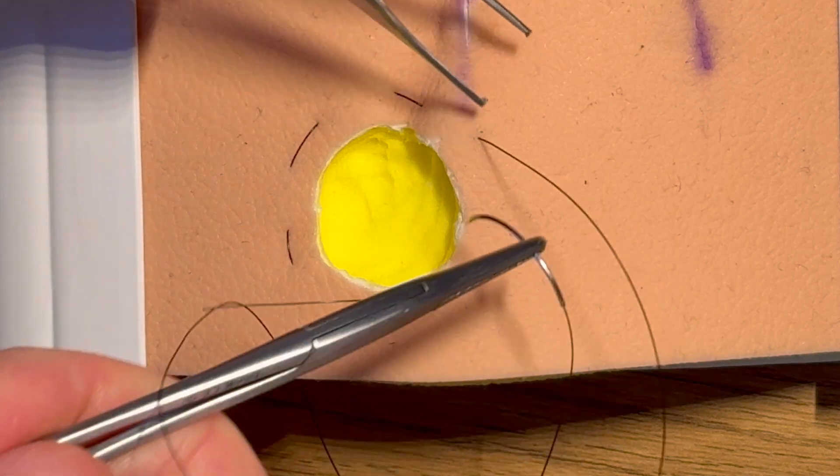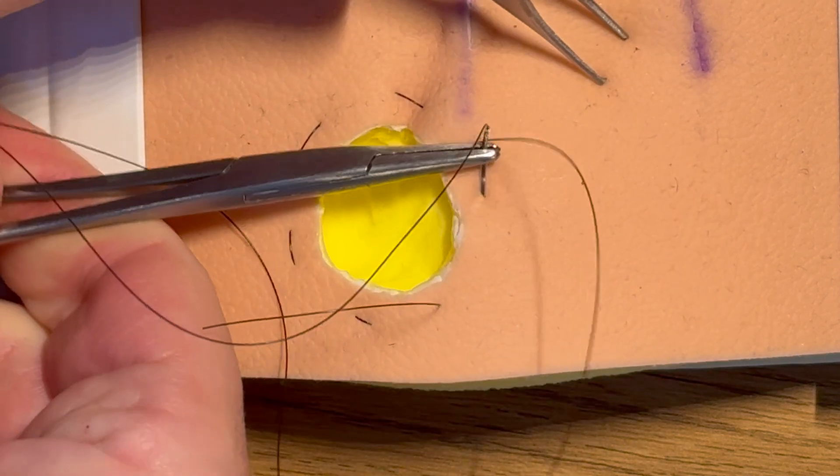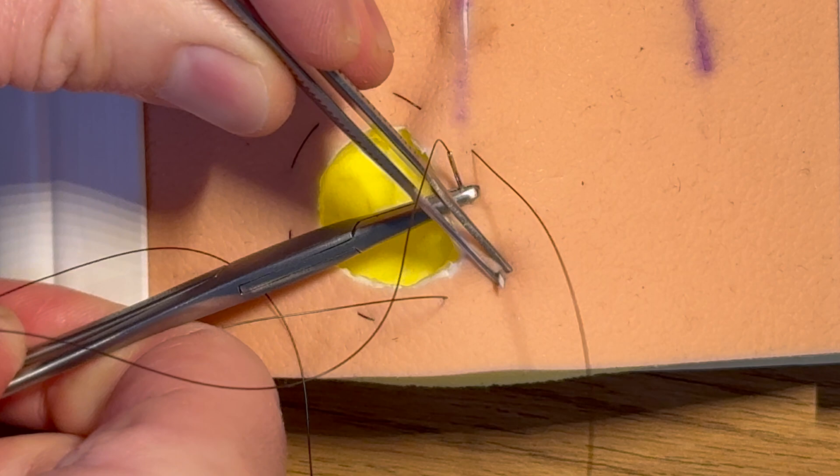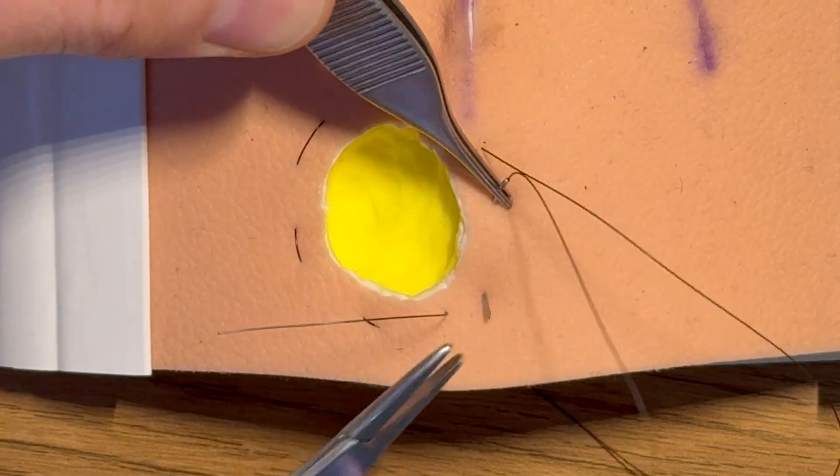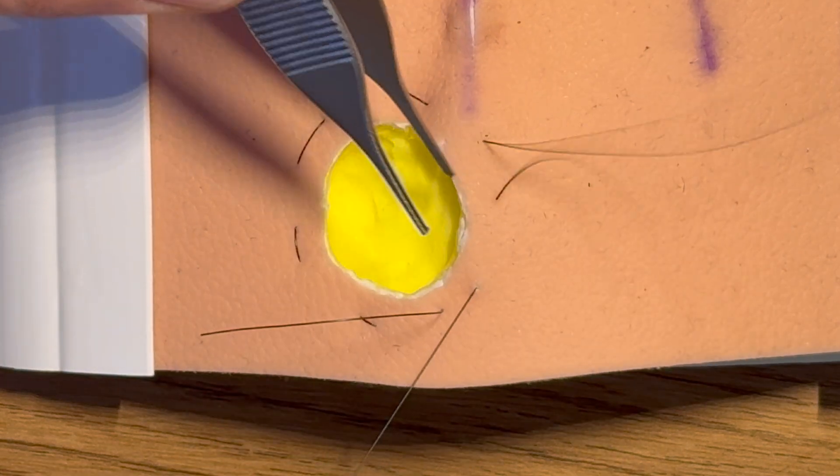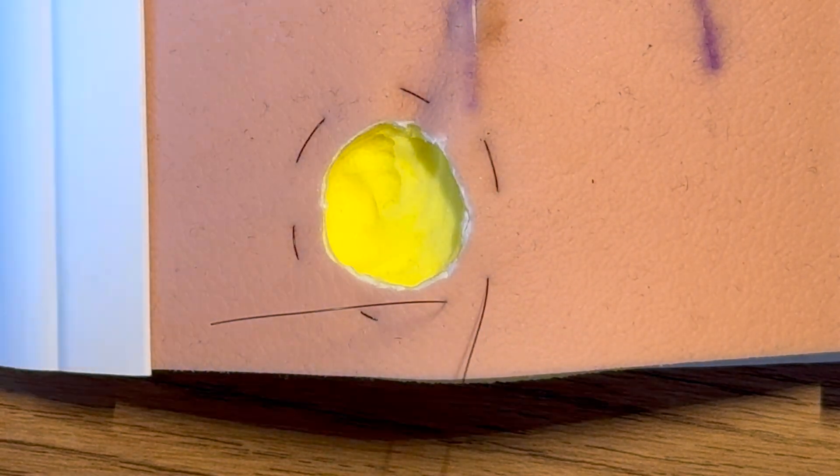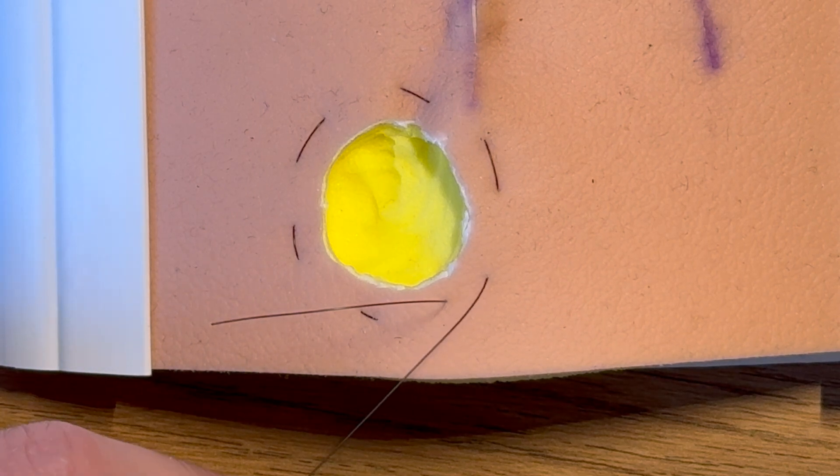And we can sew in reverse like this, sometimes that's more ergonomic. And bring it through, give it a bit more of a push so we're not grabbing the tip.